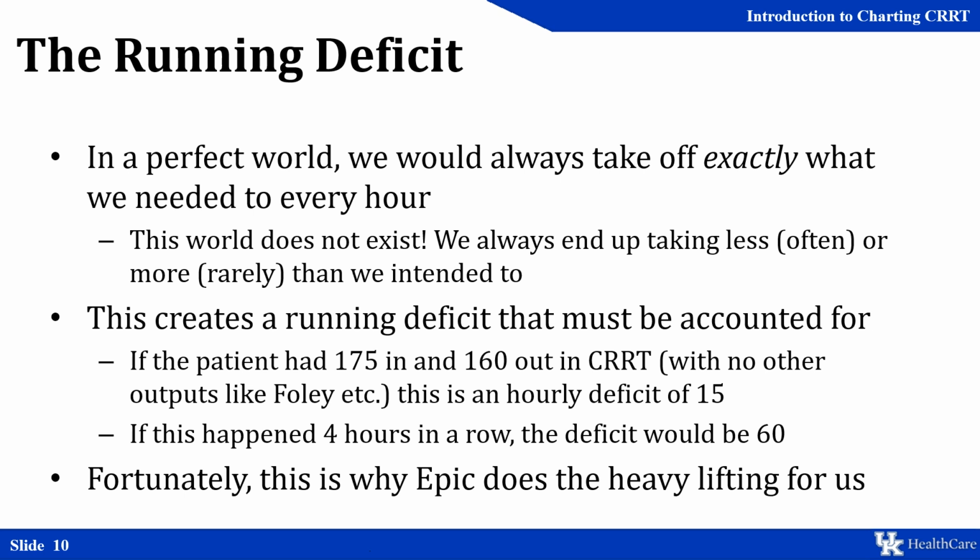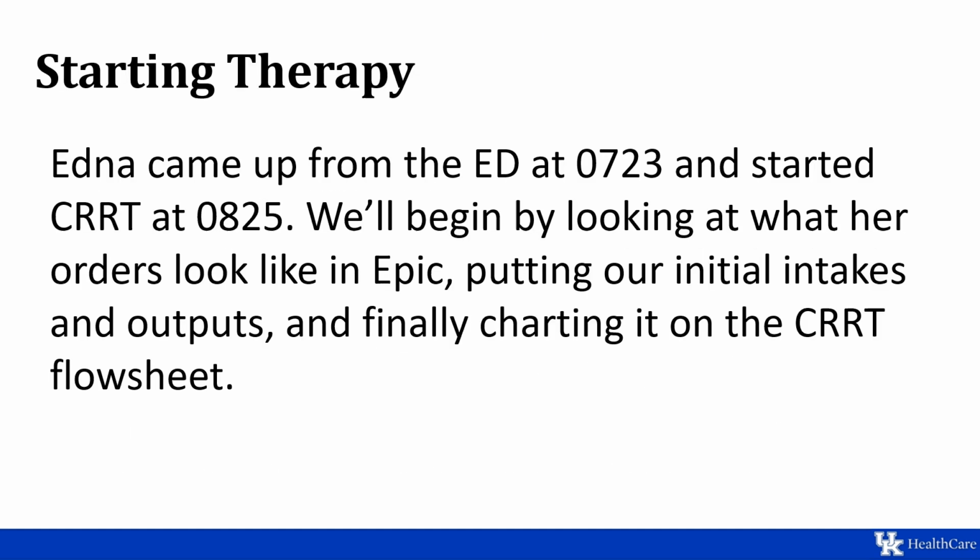Usually, the running deficit is not so small and neat to get rid of. However, when we talk about a running deficit, this is with respect to the prescription. The patient themselves will actually have a little bit of extra fluid on board from what we intended. This can get really complicated when you add up 2, 4, 20, 25, 72 hours of therapy, but this is why we have the flow sheet to do the quote-unquote heavy lifting for us.